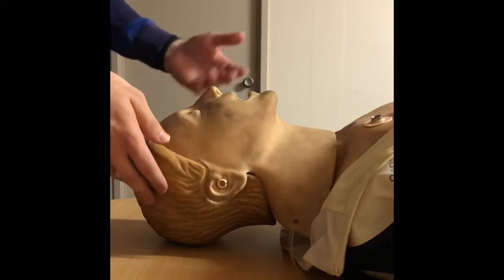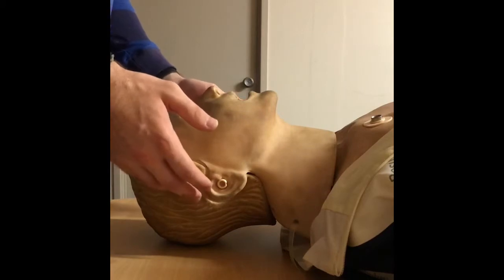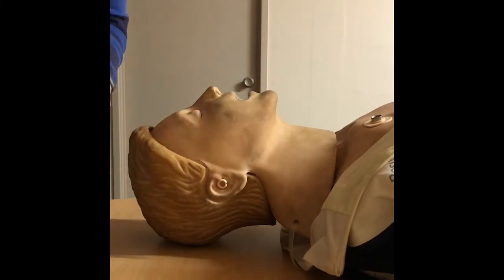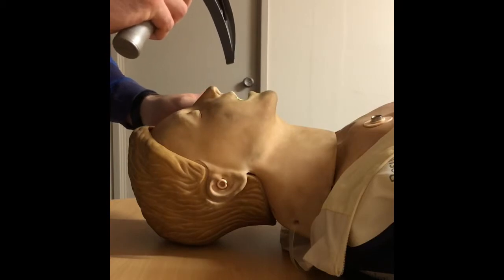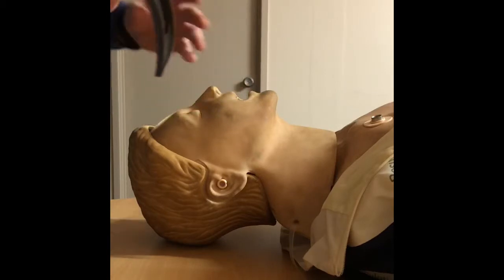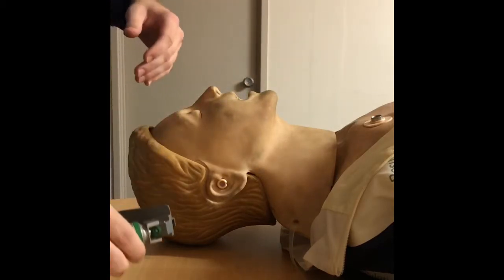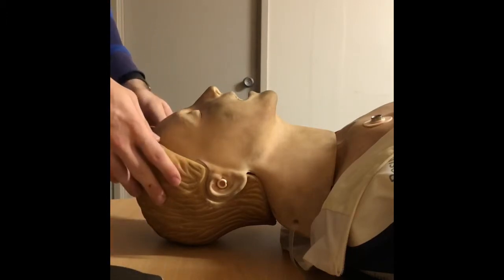So we're going to look for signs of tumours, epiglottitis, or recent neck surgery. On inspection, just going to use the laryngoscope. If I can't see any gross swelling, gross secretions in the airway there, I can ask the family regarding the prodrome and his medical history as well.